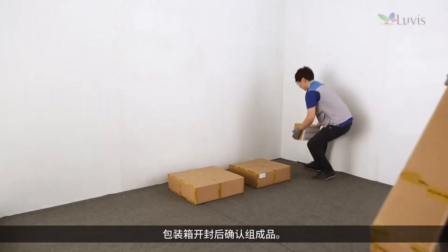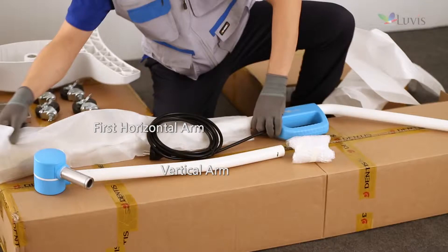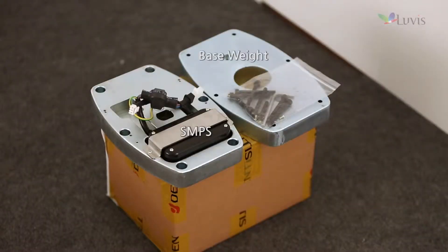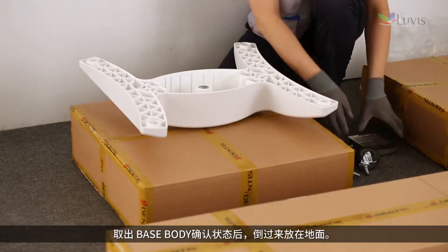Check components after opening the package box: head assembly box, horizontal and vertical arm box, base body and caster box, base weight and SMPS box.